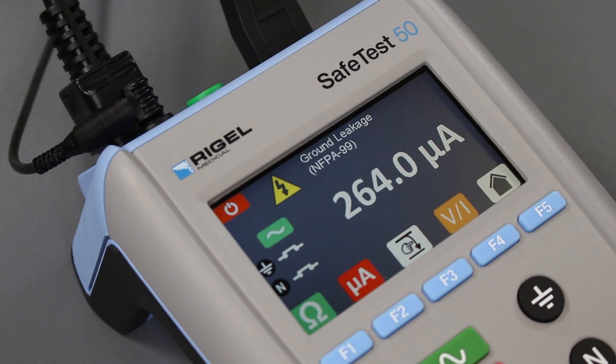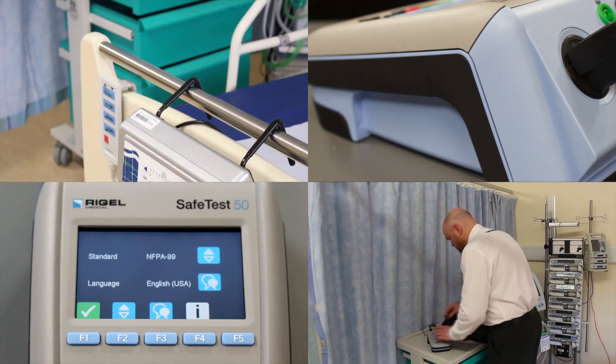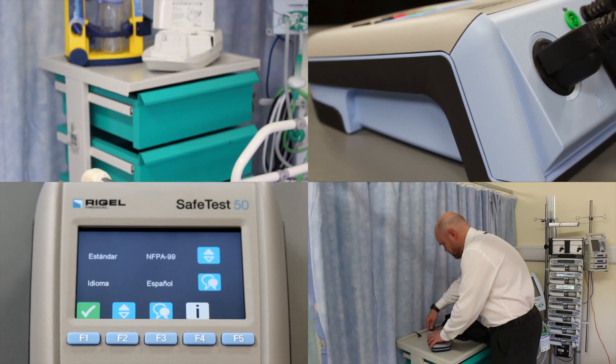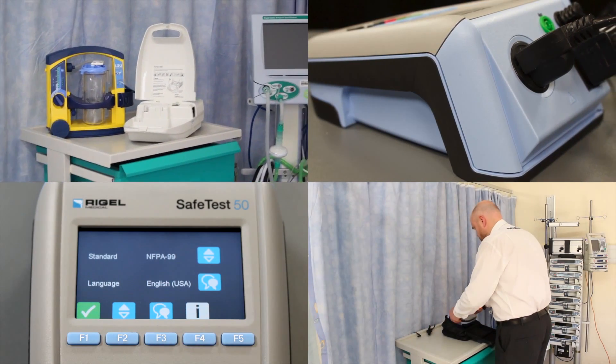Available in a number of mains socket configurations and with selectable language settings, the SafeTest 50 is a versatile and rugged solution for quick and cost-effective testing of electronic equipment in the medical and laboratory environments.